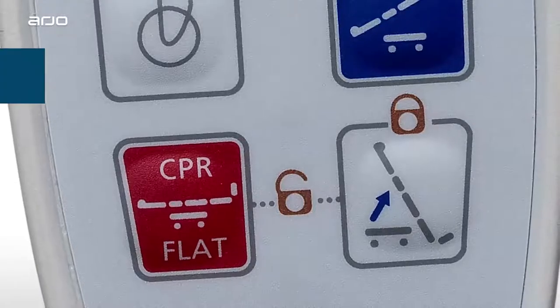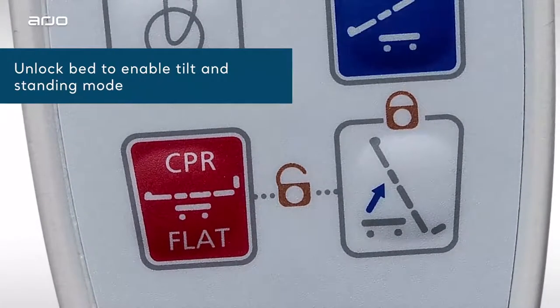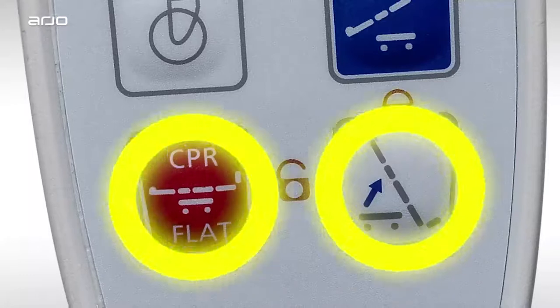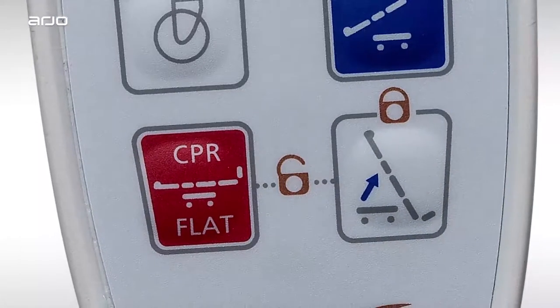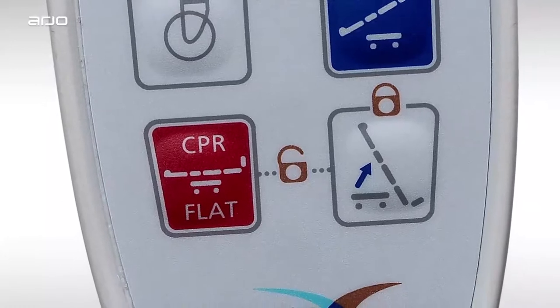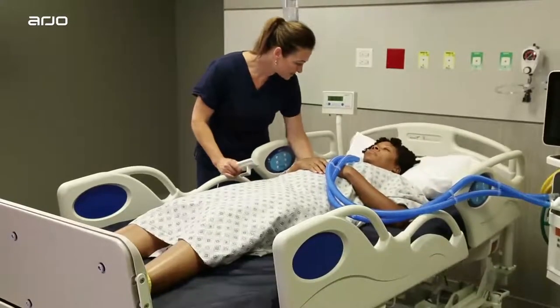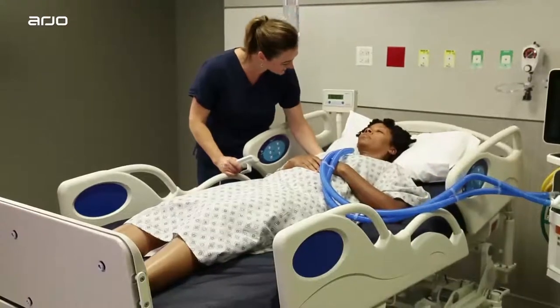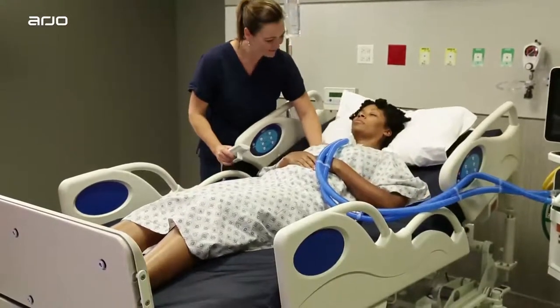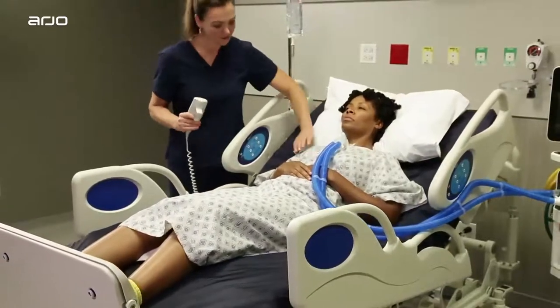To enable progressive upright positioning, you will first need to unlock the bed. Simply press and hold both the CPR flat button and the upright button at the same time until you hear two beeps. For safety reasons, the bed will automatically lock after 90 seconds of inactivity. If the bed has been automatically locked, you will need to unlock it again to tilt to a higher angle.